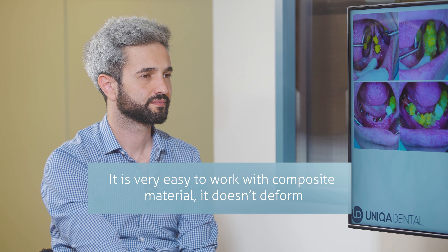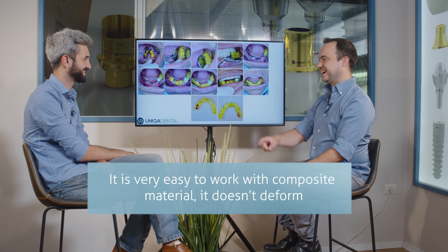It won't deform — unlike wax. This is already the temporary restoration. Yes, this is the temporary restoration for the lower jaw. You can see there are a couple of implants we added and the implants that were placed before.